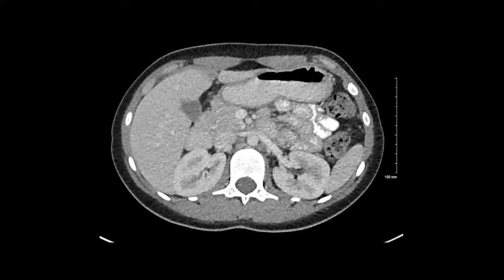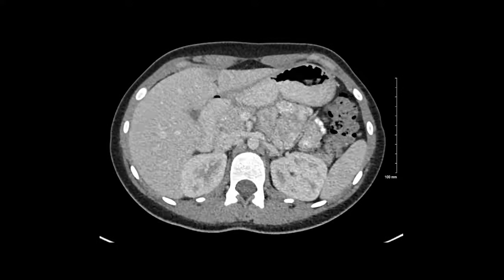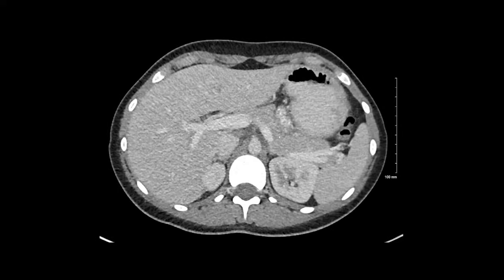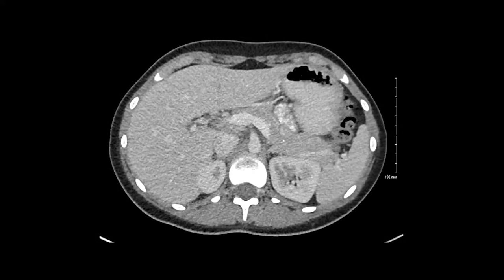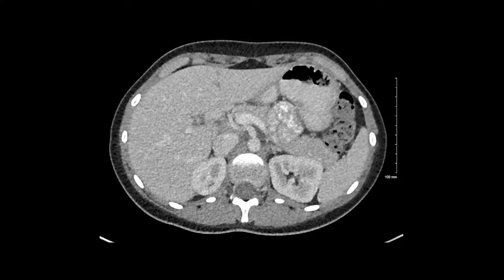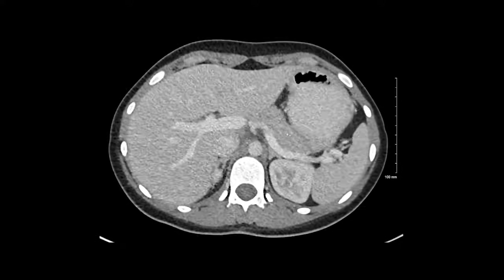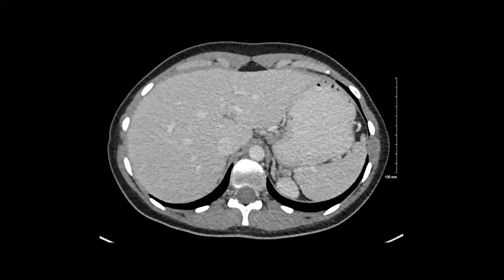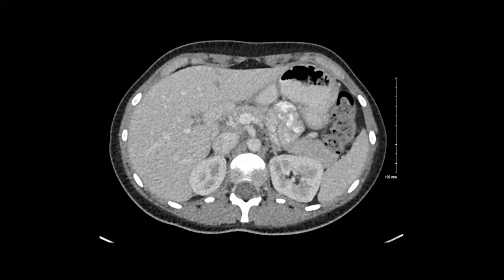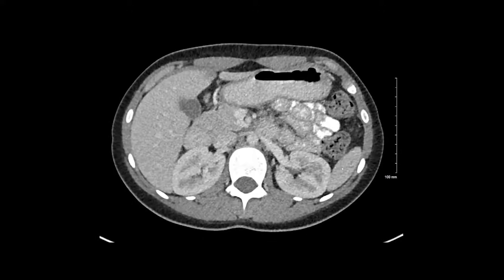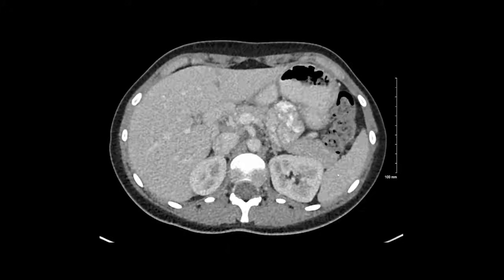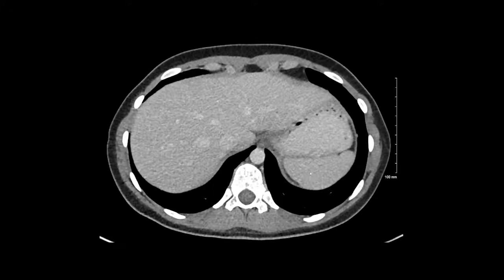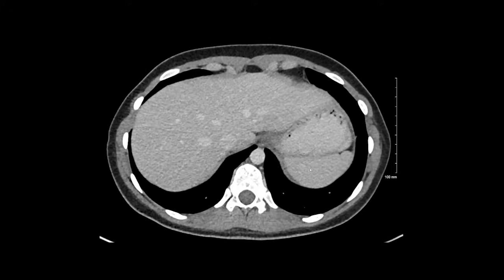Next, I will track the pancreas up through the retroperitoneum, looking at the pancreatic parenchyma for any nodules or masses and any evidence of pancreatic duct dilation. After the pancreas, I will move to the spleen in the left upper quadrant, again looking for nodules or masses, and also looking for any evidence of splenic enlargement. The spleen is normal.